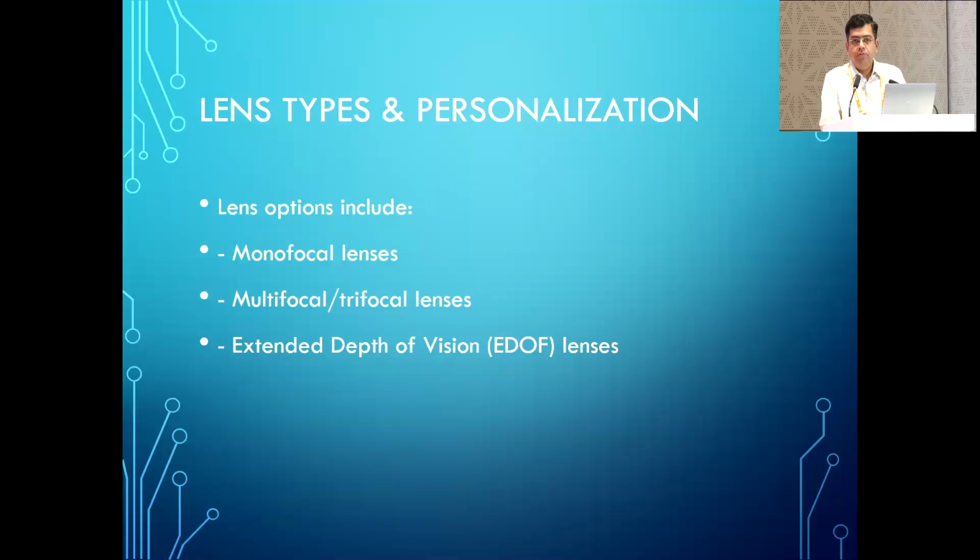So what type of lens can be used for personalization in these patients? We want to give them glass-free vision. That means happy patients, so it's not 20/20 or N6. So the options are, don't throw away the monofocal lenses. It is mandatory to have monofocal lenses also in your practice when you want to do mix and match in patients with variations. So use of trifocal lenses is very important.